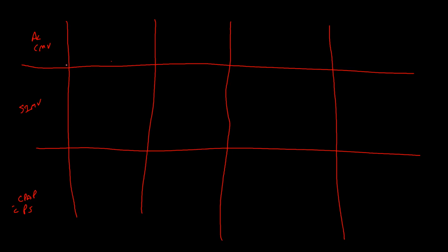So assist control, if we are on a respiratory rate of 10, we're just going to say respiratory rate of 10 for the SIMV also. We are going to have one machine-driven breath every time we get to a new window. That's just what the ventilator does.